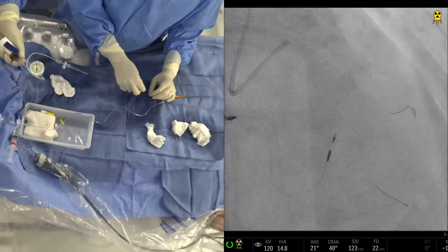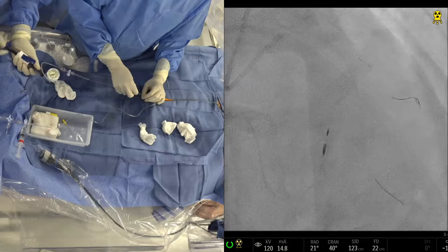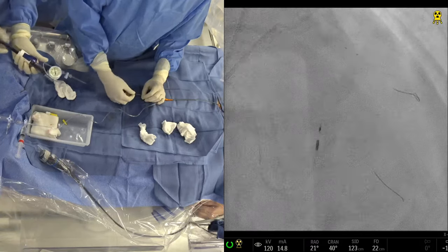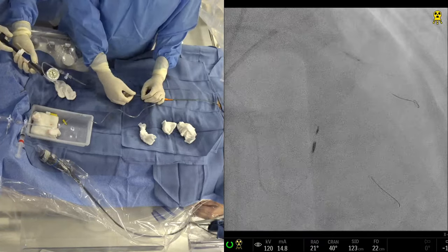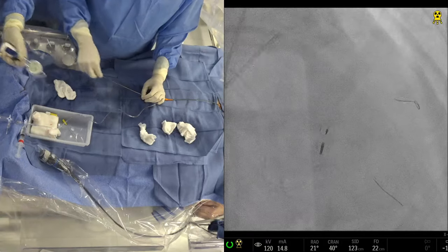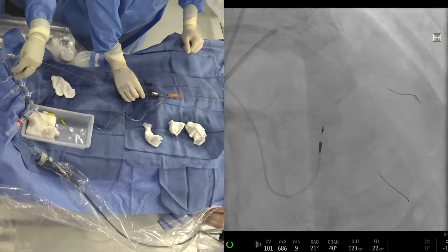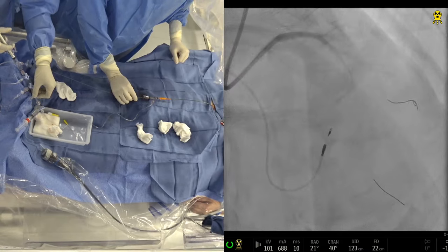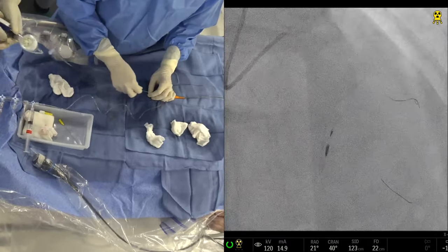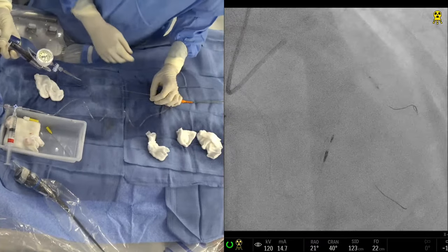And remember, the question comes when you're trying one versus two stent approach, the Definition trial and most of the trials have shown once your lesion length is more than 10 millimeter, that's kind of a tiebreaker. So in those cases, you should go with a two stent approach, because the chances that you'll put a second stent will be much higher. And we know that in the DK Crush 5, 46% required a second stent approach. So my feeling is, this is a long lesion of the second diagonal. The first lesion is about 15 millimeter. So both lesions are long, which should go with a planned two stent approach. Now, there is mild disease, this will go with a longer one then, 33. No. I think 28 may cover this. Go up here. I know. We know that. Yeah. That's why I didn't say that. Yeah. Okay, down.